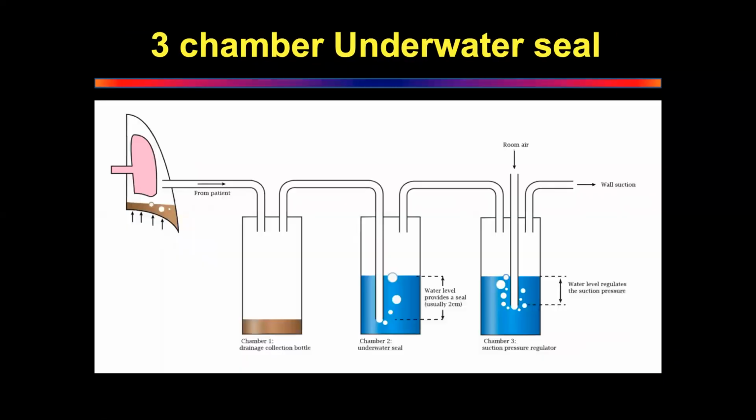3 chambers. So now somebody take this and explain to me why this is better than 2 chambers. Because the first bottle is not in continuity with the last negative suction bottle. Excellent. That is the important philosophy. Somebody said I didn't understand. Was that Shilpa you said that? No. Earlier somebody said I didn't understand. Anuj. Okay, 1 minute.